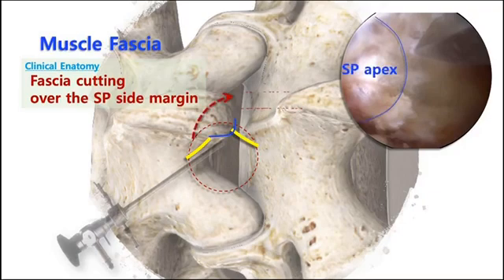So if you cut it off and the fascia is already cut into two pieces, you can see the SP base directly and easily when you lift up the scope to see the contralateral side. Then you can move easily to the next step.